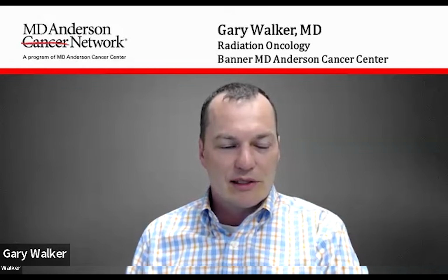External beam radiation therapy acts through the interaction of photon radiation with individual cells, particularly cancer cells. So these X-rays enter the body, they interact with the water particles, and they create free radicals. Free radicals damage the DNA of the cancer cell, causing both double-strand and single-strand breaks in the DNA, and cause the cancer cell to hit the self-destruct button and then die off.